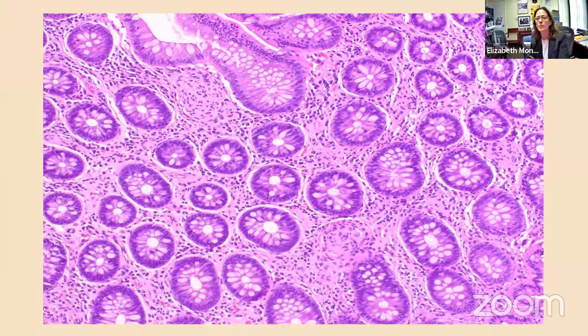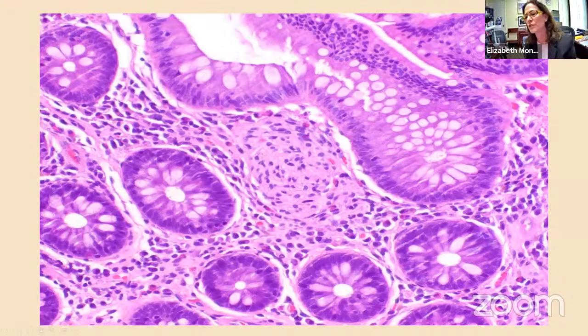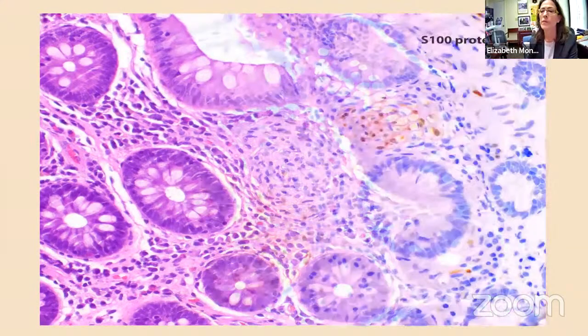So this is a colon biopsy, and I nearly missed this finding, gulp. But after you look for a sec, you'll see this little guy here and this little guy here. Here's another area, or one of those at higher magnification. So I became very concerned that this patient could have a mucosal neuroma.